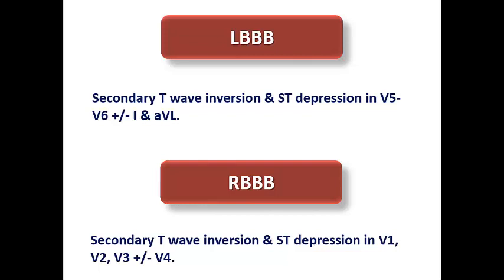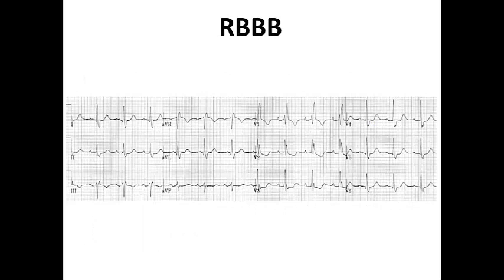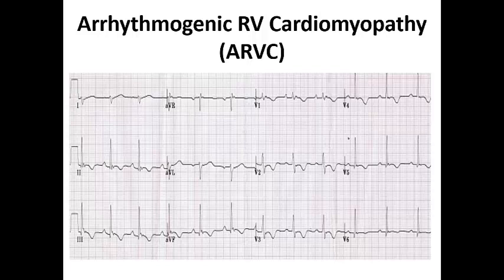In bundle branch blocks, the distribution is nearly the same as ventricular hypertrophy in the corresponding chamber. In left bundle branch block, secondary repolarization abnormalities occur in V5, V6, and sometimes I and AVL. In right bundle branch block, they occur in V1, V2, V3, sometimes V4. Here we see ST depression and T wave inversion in V5 and V6, indicating secondary repolarization abnormality with left bundle branch block. In right bundle branch block, ST depression and T wave inversion appear in V2 and V3, with T wave inversion in V1 without ST depression.